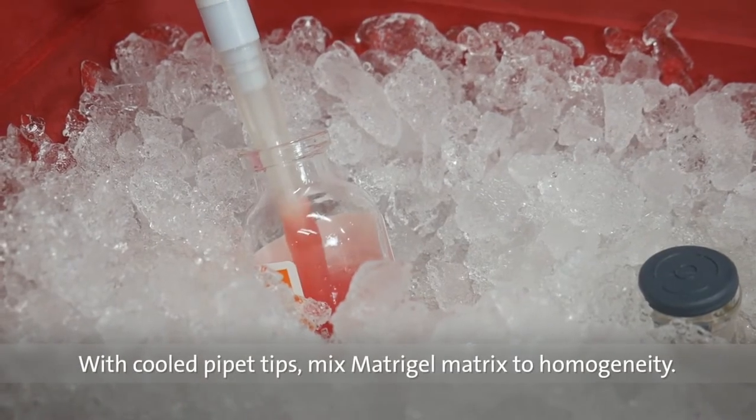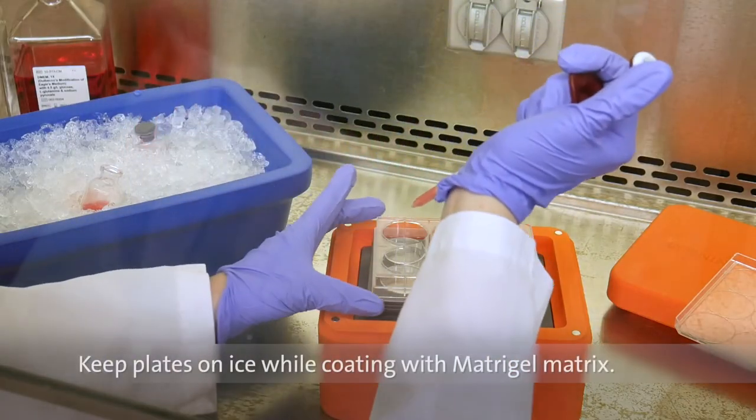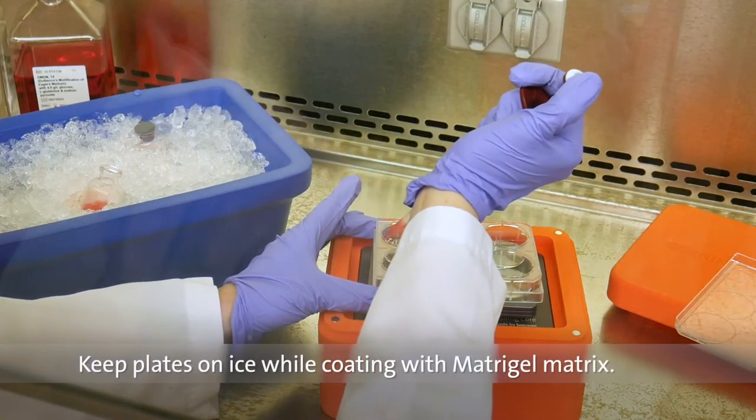Using cooled pipette tips, mix the Matrigel Matrix to homogeneity. Keep culture plates on ice and add 50 microliters per square centimeter.